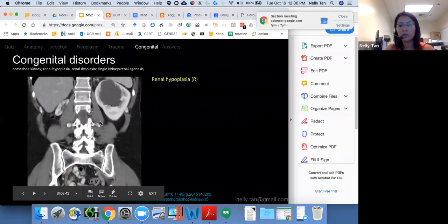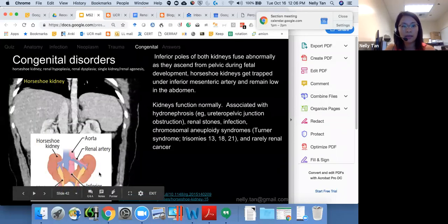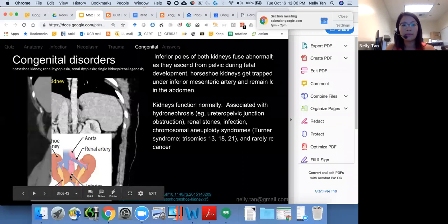Here is another congenital anomaly. I thought it was the IMA. Oh, yes, I think I made a mistake. Yeah, you're right. It's the IMA, JJ. The SMA is up here above the renal vessels. And here are presumably the two renal arteries, and then here's the IMA.